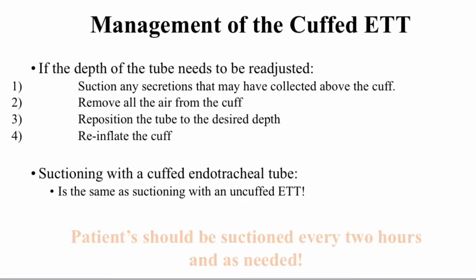Management of the cuffed endotracheal tube. If the depth of the tube needs to be readjusted, suction any secretions that may have collected above the cuff, remove all air from the cuff, reposition the tube to the desired depth, and reinflate the cuff.